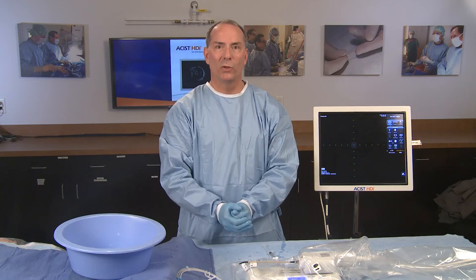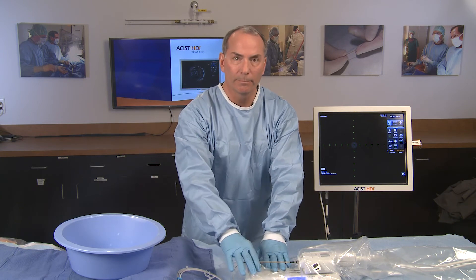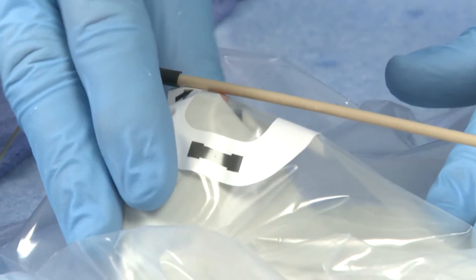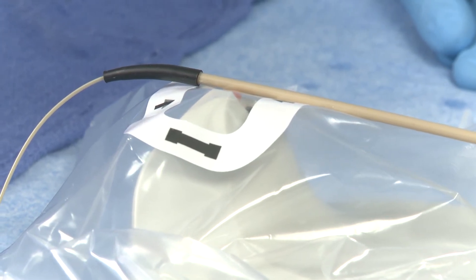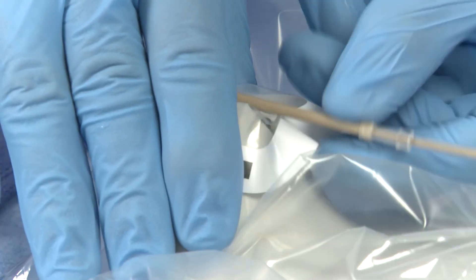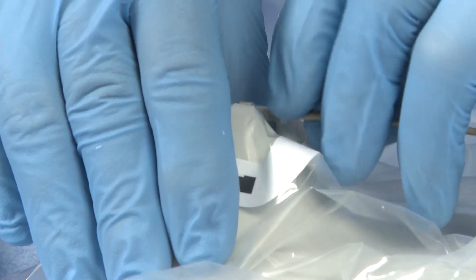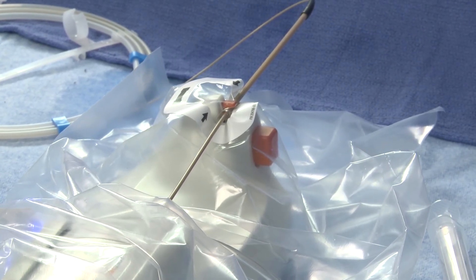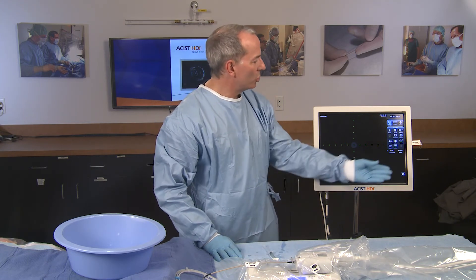Slide the sterile sleeve so the anchor window is over the groove on the front of the LTS. Leave sufficient folds of sleeve material between the front of the LTS and the PIM nose to allow free movement of the PIM and LTS assembly. While pressing the orange button on the side of the LTS, slide the telescope anchor into the LTS groove. Ensure the orange hook is fully closed and centered on the telescope anchor. Confirm the mated indicator on the touch screen turns from orange to white.